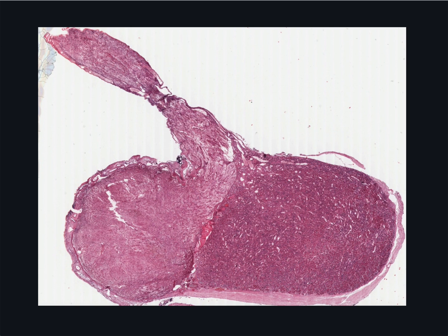So really, the terms acidophil and basophil that I've used here are really misnomers. The granules of both cell types are actually acidophilic. The stain that differentiates them is the periodic acid-Schiff reagent stain, which is a major component of the polychrome stain that was used in the previous section.